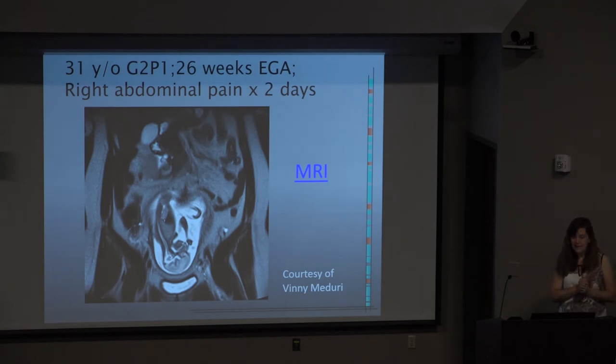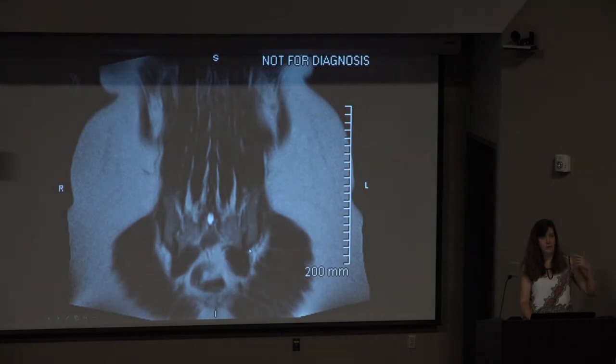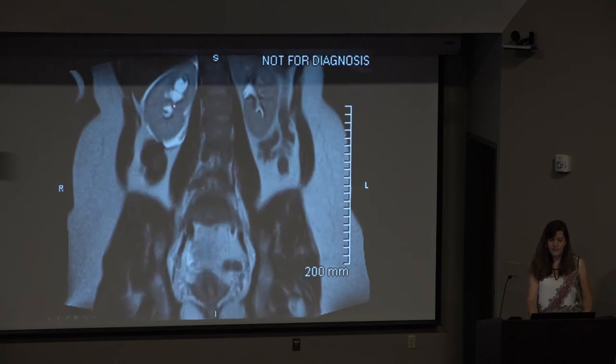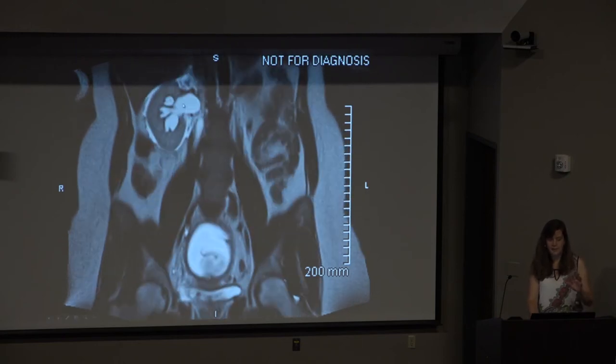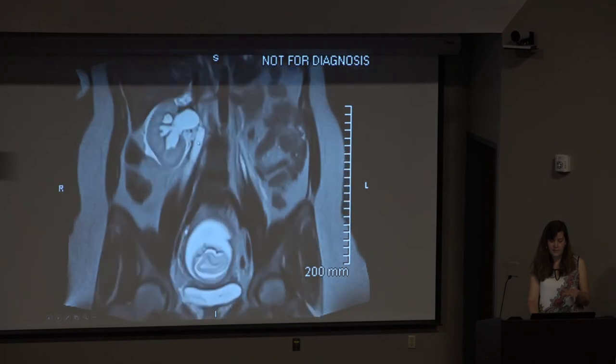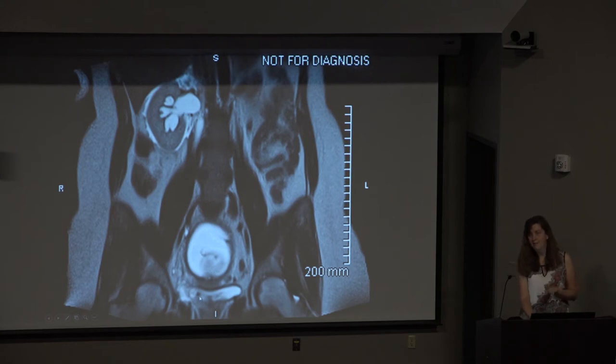Okay. All right. This is the last case, and then we'll move on. So 31-year-old, 26 weeks pregnant. She's got some right abdominal pain. Here's the MR. We did ultrasound, she had hydro. Many times pregnant women have hydro, right? So now we're looking for appendicitis because they said, well, the hydro is due to being pregnant. So here is the right kidney, and yes, this is hydro, fluid in the kidneys. If you compare to the other one, you always have another kidney to compare to, that's abnormal, right? But there's also fluid around that kidney, and that ureter is very big. It's kind of wiggling around here, and right where it comes into the bladder, there's a black dot. And that black dot is a stone. So this was a stone, very small. Again, no surgery necessary here.